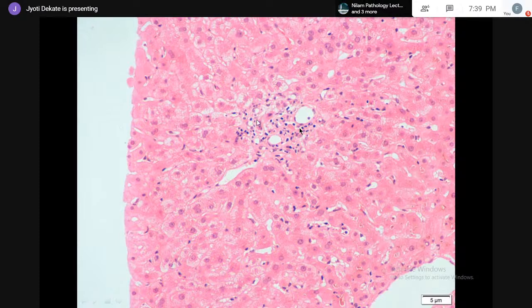There is this bile duct epithelium, bile duct branch here. The lumen is kind of obliterated here, and there is loss of nuclei in one part of the bile duct. Some of the nuclei look enlarged, and the cytoplasm appears hypereosinophilic. There is hypereosinophilia of the cytoplasm. This is called senescent changes in the bile ductal epithelial cells. There is no evidence of portal venulitis. There is no evidence of central venulitis.